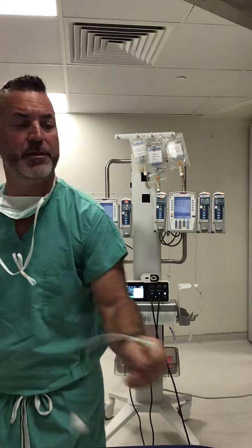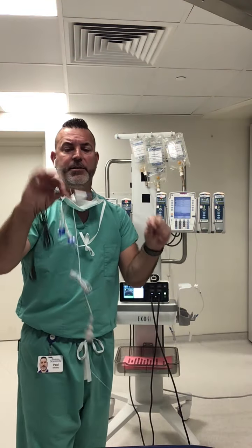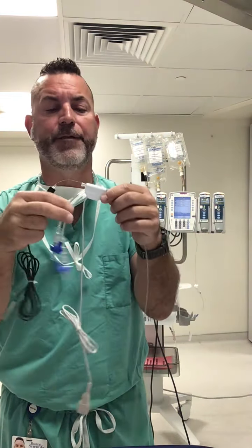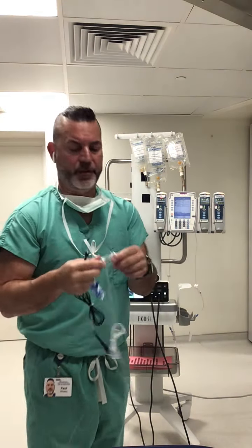I'm going to put him off to the side for just a minute, and I'm going to talk about my catheter. So this is my EKOS catheter. My EKOS catheter has 2 pieces: the EKOS IDDC, or infusion catheter, and then I have an ultrasound wire or MSD wire, okay? So it's a black wire and a white wire. They come separately in the package. Let's talk about both of them.